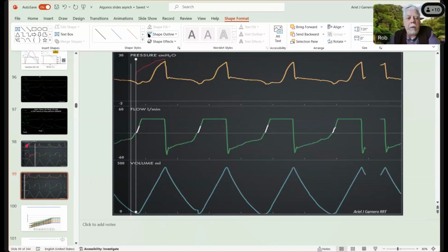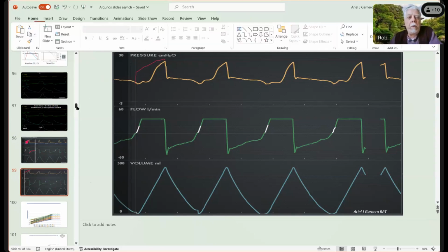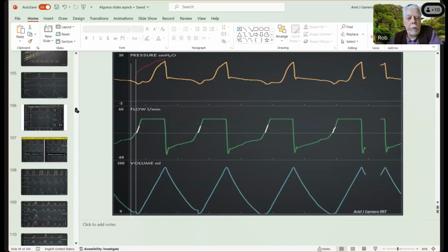Right. And if this patient was indeed a patient with high expiratory resistance, maybe a COPD patient, and at some point they were failing to trigger, then maybe NAVA would be the way to go for that patient. For all those reasons you just said, and plus, avoiding any trigger problems because they couldn't generate the flow at the airway opening because of auto PEEP.